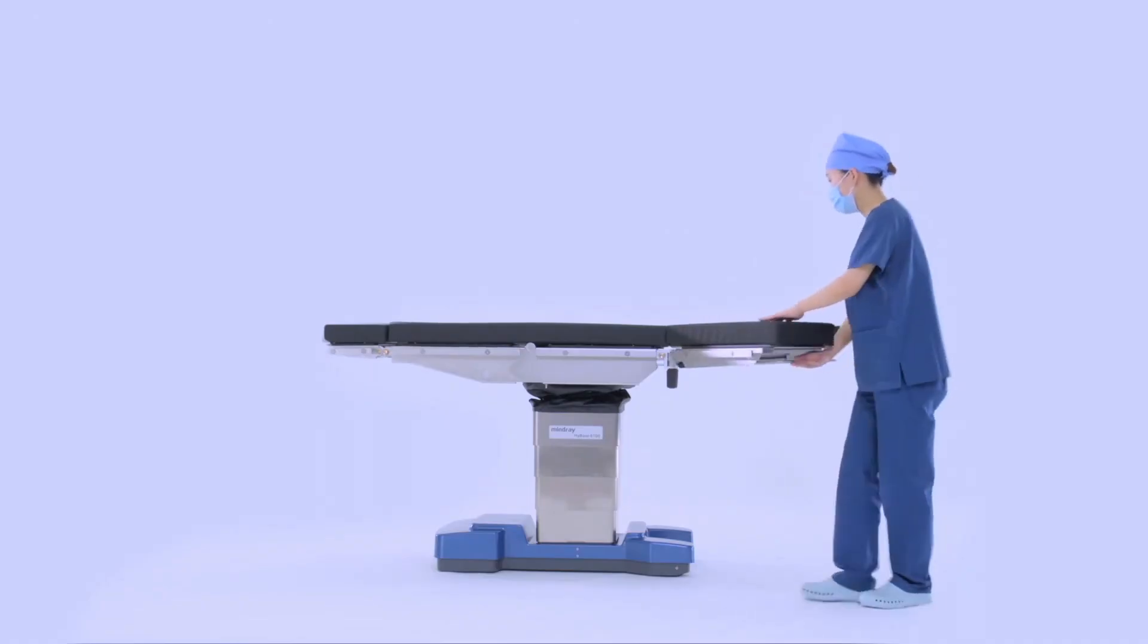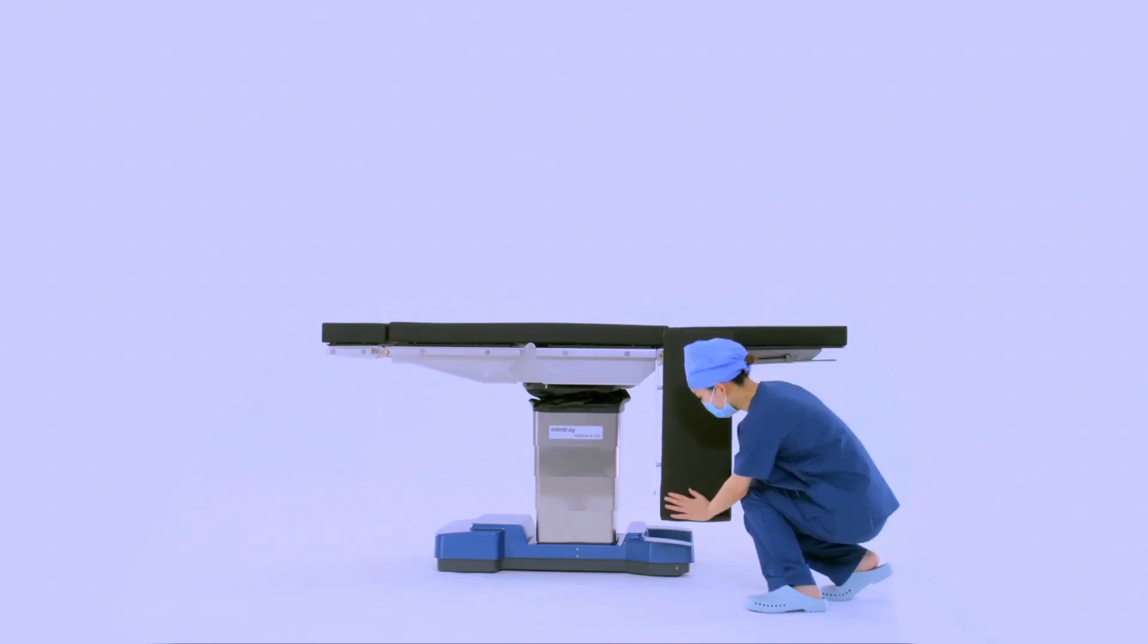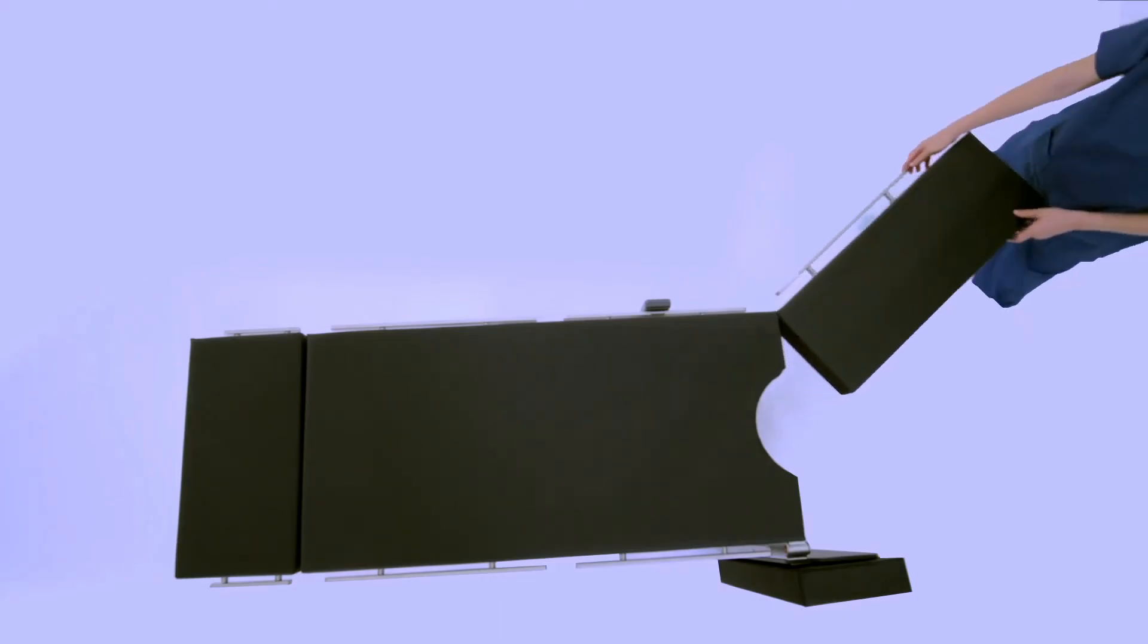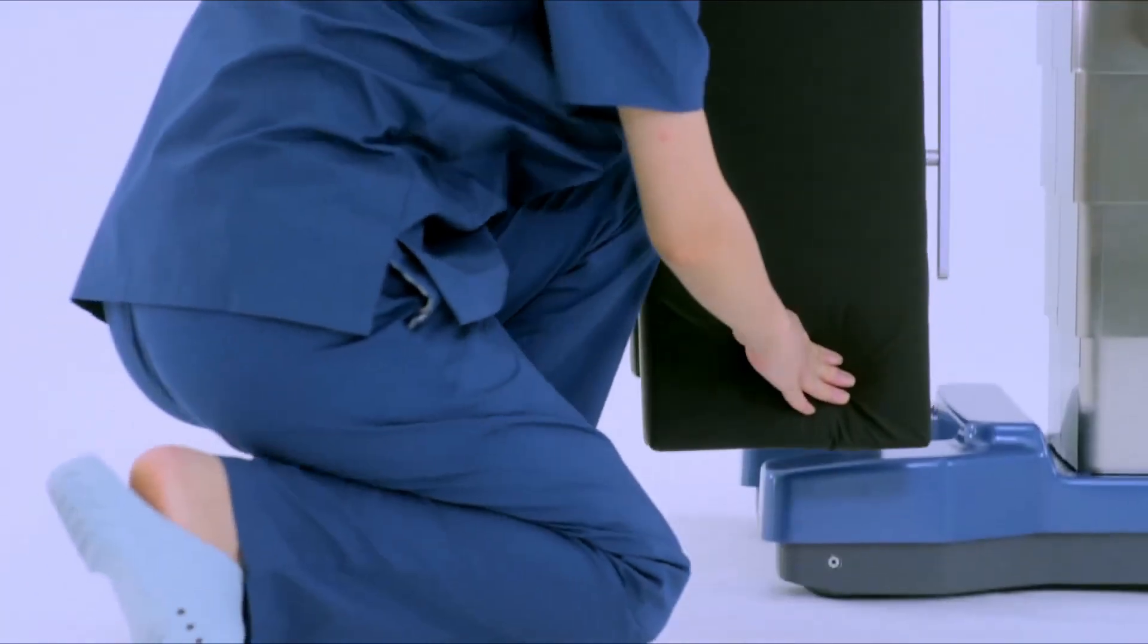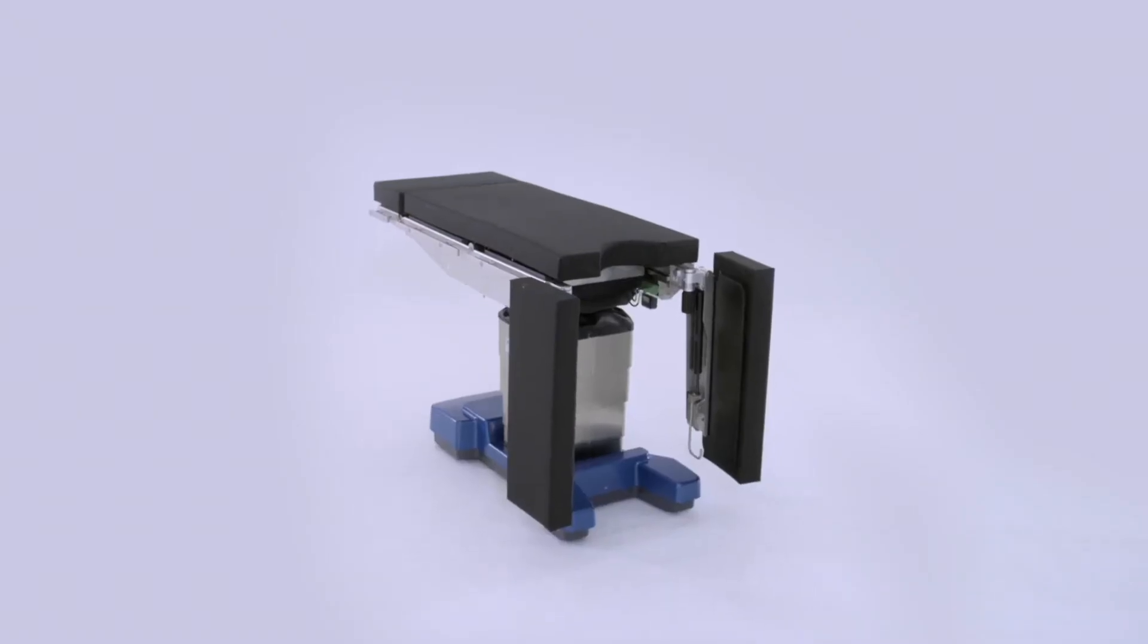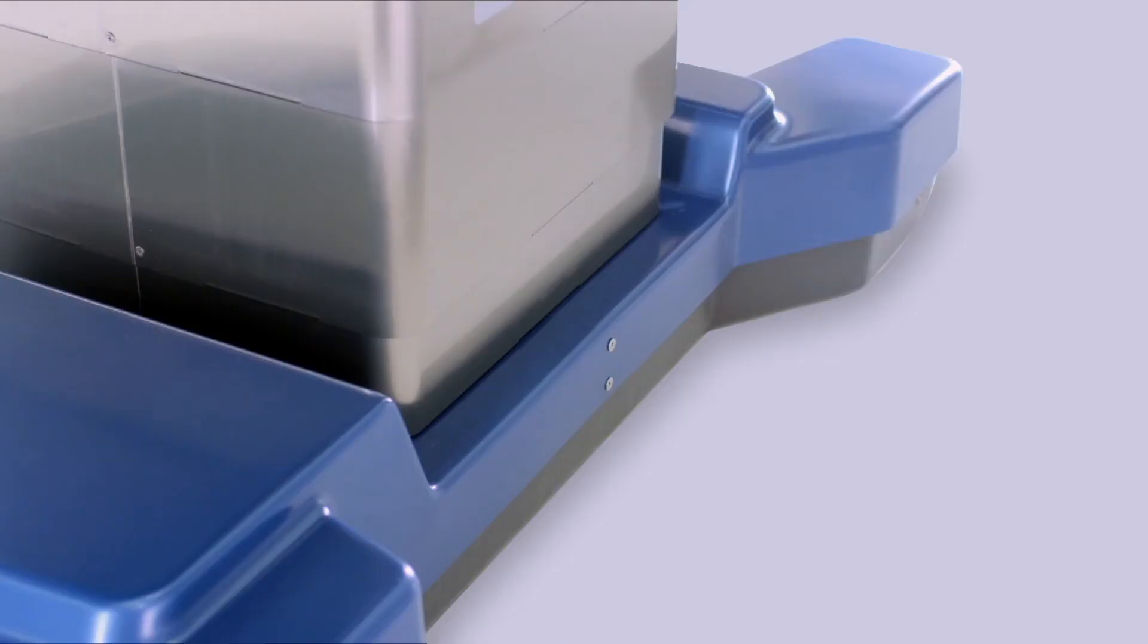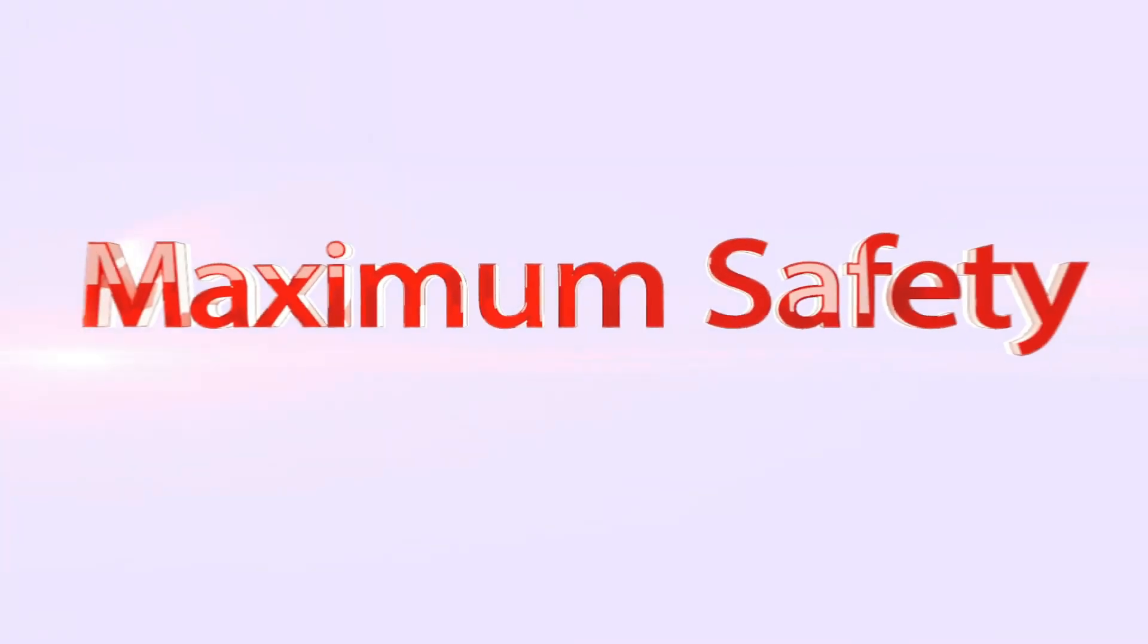As you can see, there's more to OT beds than just a flat surface. Surgeons need them to adjust in all sorts of ways to make sure the surgery is as safe and effective as possible. Whether it's a small manual adjustment or a fully electronic system, the type of bed used depends on the specific surgery and the patient's needs. Let's look into the components of an operation table.